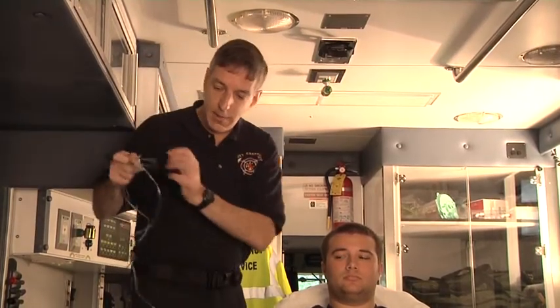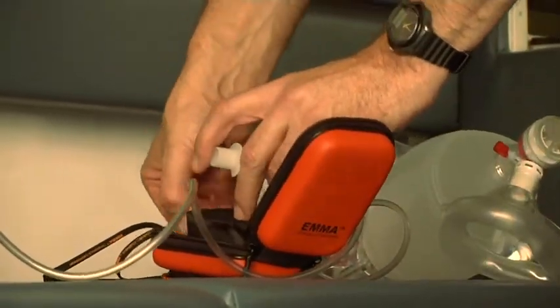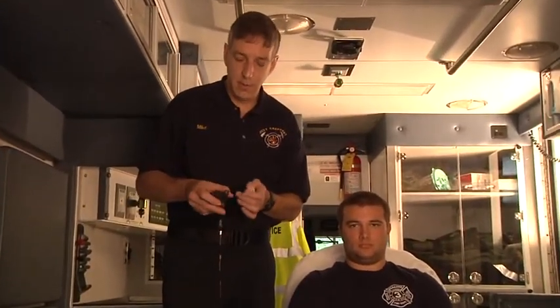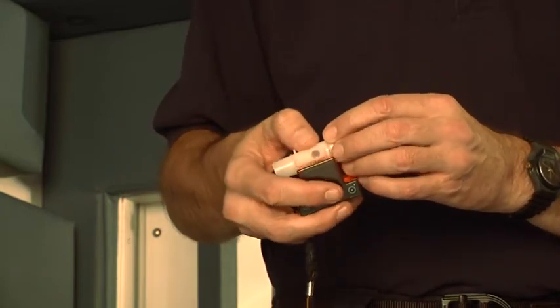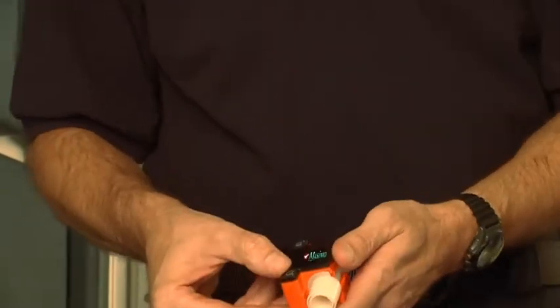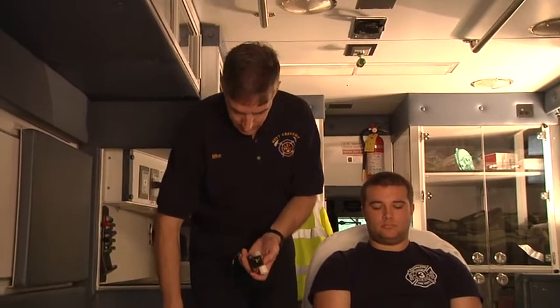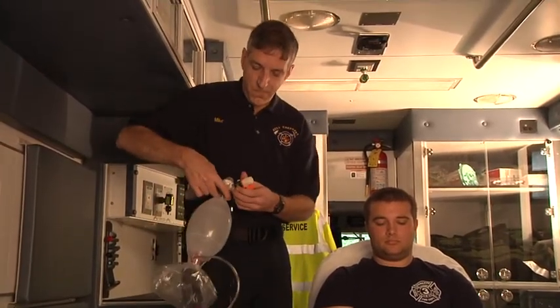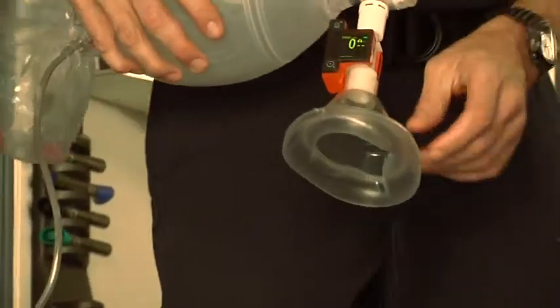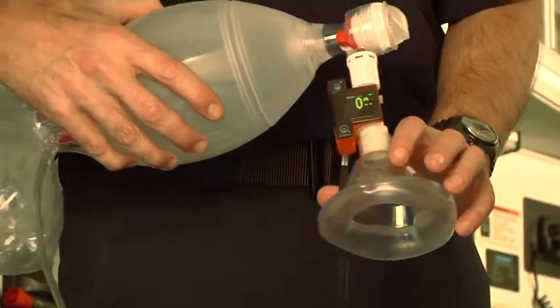At the basic life support level, there's now a portable capnography device that can be attached between the bag valve mask and the patient to give you an exhaled carbon dioxide value. It has an adapter that snaps into the device, turns on with a very small power switch, then connects directly to the bag valve mask and allows you to see a respiratory rate and an exhaled carbon dioxide level from the patient.